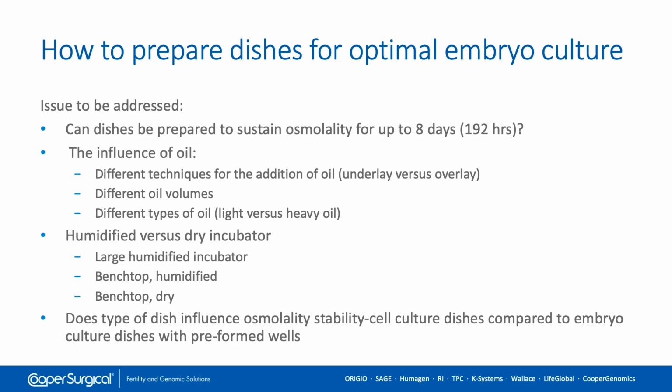So does the type of dish influence osmolality stability? It does. Cell culture dishes can have an impact, and those that have preformed wells for embryo culture seem to do better. And from the studies that have been done, certainly if you underlay your drops, this is the best way to prepare dishes. So you put your drops in the dish, you put oil over the top, you remove those drops, and then you replace them with new drops straight under the oil, so they give the least amount of risk of evaporation.